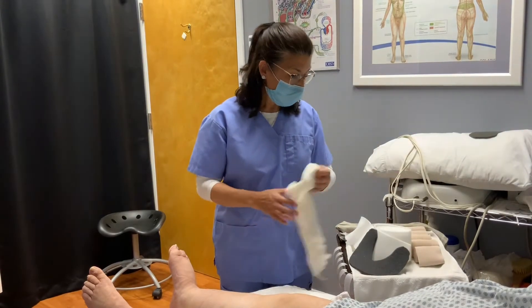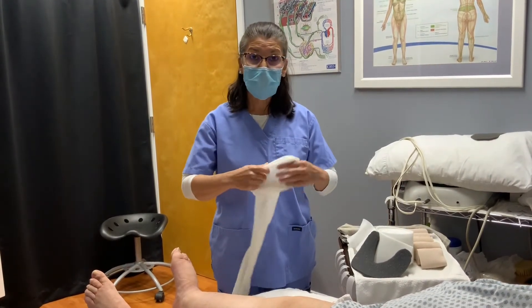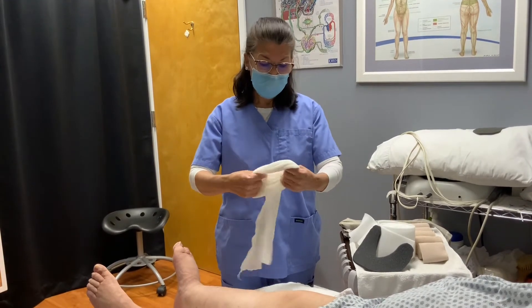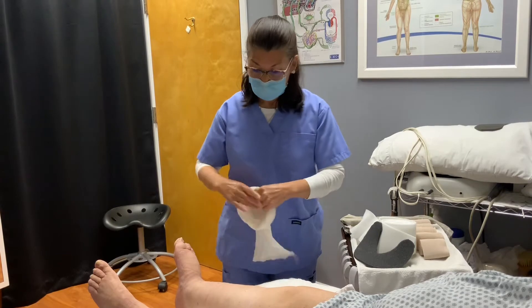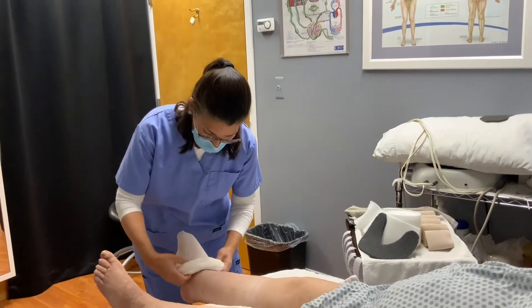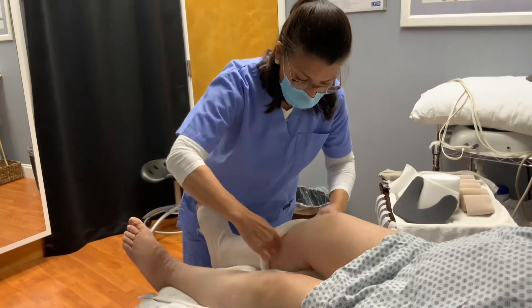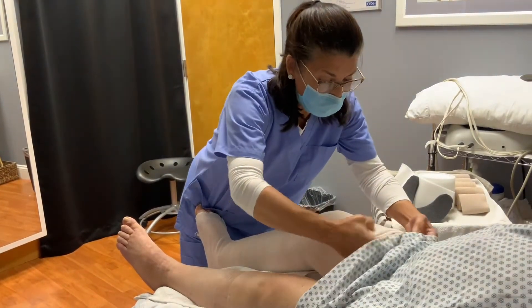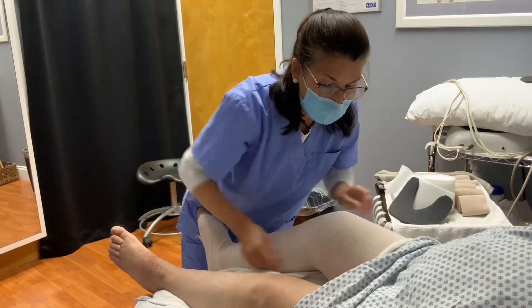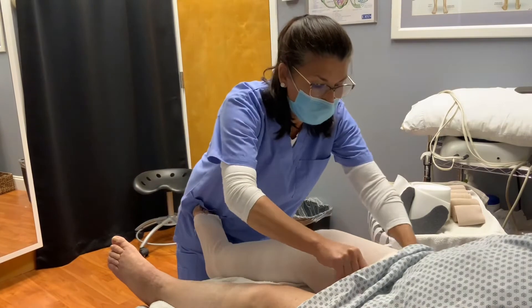The first thing that we're going to apply is a stockinette. TricoFix is one of the brands that you can use — it's soft and it can also go all the way up to the thigh. If the patient is able to bend the knee, you ask for their help. If it's difficult for them, then you may have to bend their knee or move their extremity.